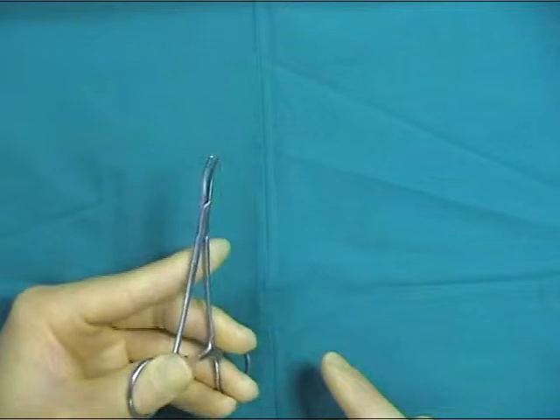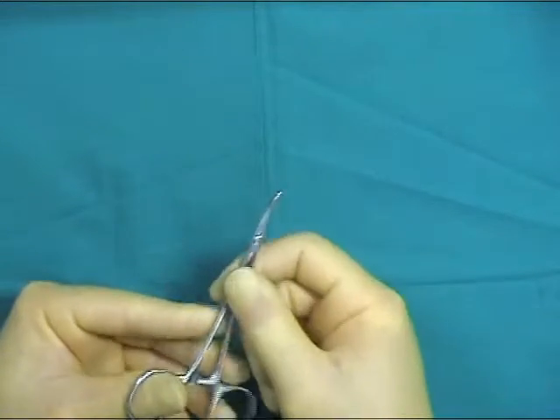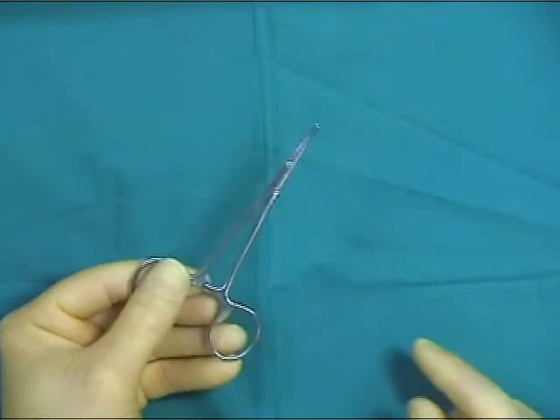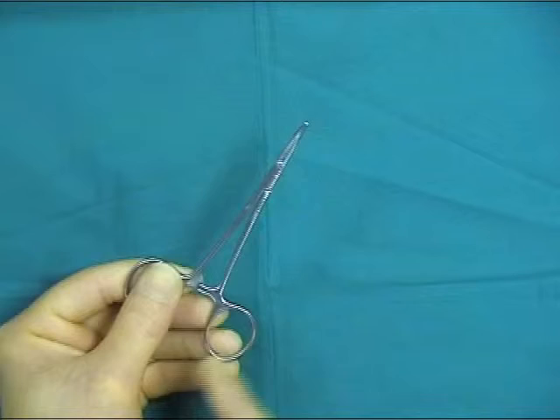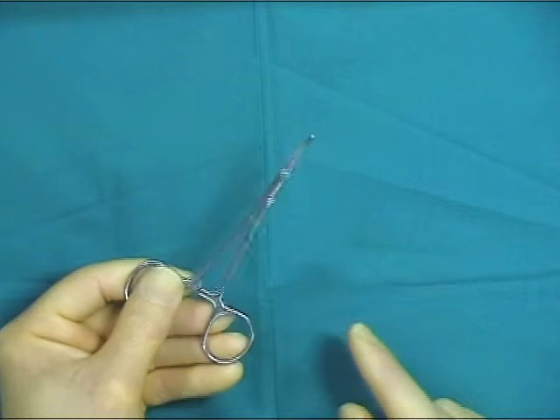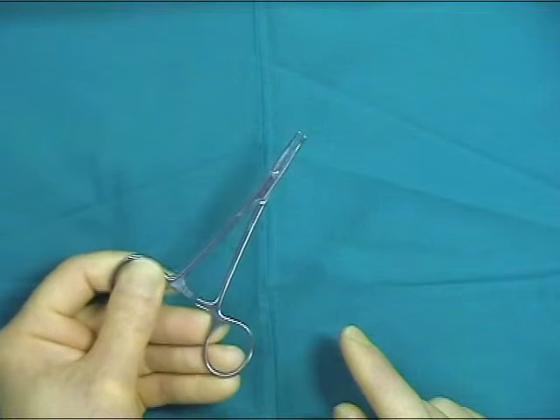If you cannot master pulling the thumb towards the hand, the alternative way is to use the open palm technique, utilizing the thumb and index finger on one loop of the hemostat and the middle and ring fingers on the other loop, opening the hemostat like this.